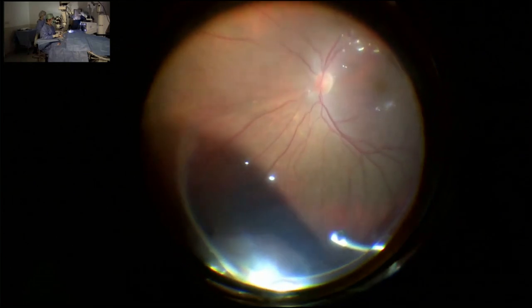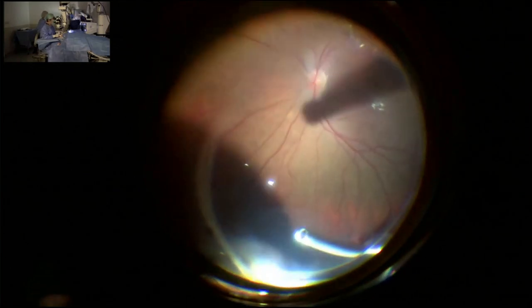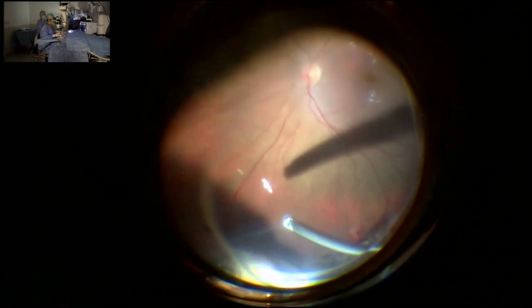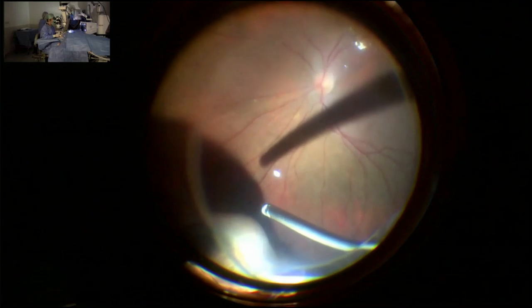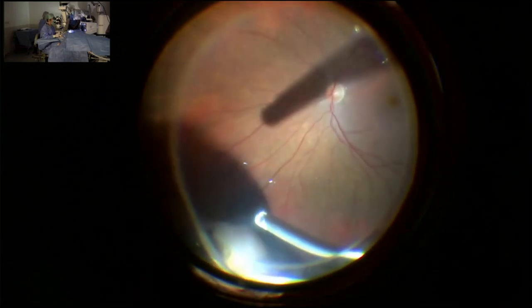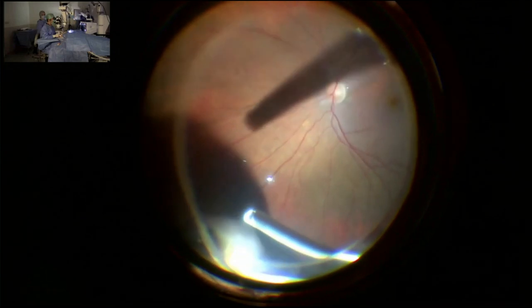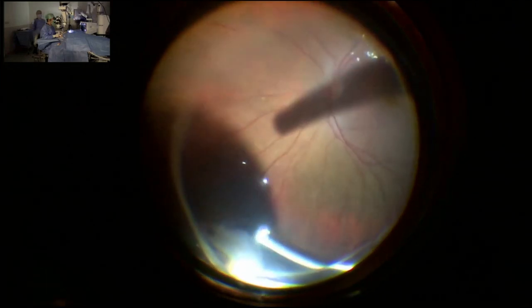We are going to shaving mode now. During this, the area is very mobile retina, and therefore we need stable retina. As you see, we can clean the vitreous, but there is no fluctuation of the retina because the pressure is so low, and also we use flow mode, not the vacuum mode of the pump system.